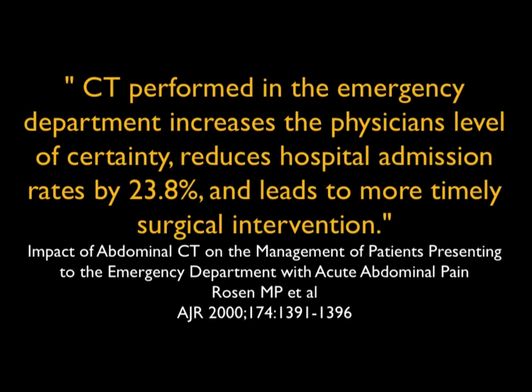We talk about this level of certainty. When your physician sees you, you want them to be certain. You don't want them to say it could be X, it could be Y, it could be Z. You don't want a differential diagnosis. You want one answer. And a quarter of the time, CT provides the answer you didn't know.